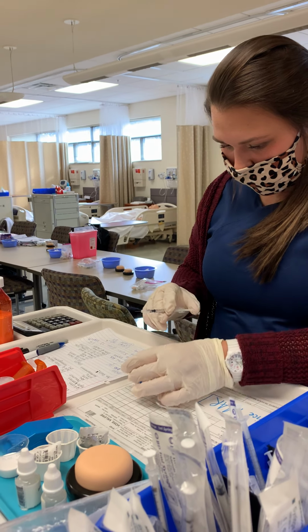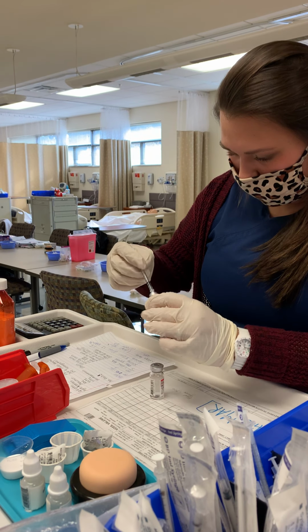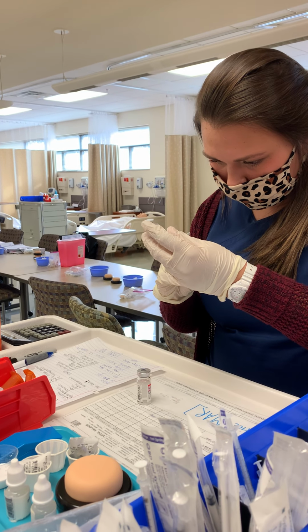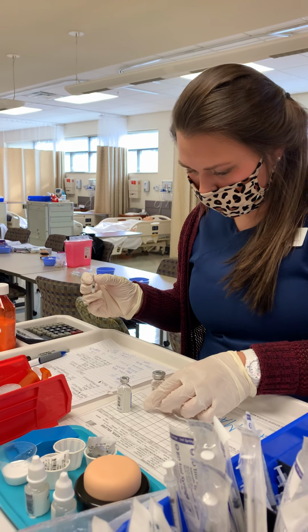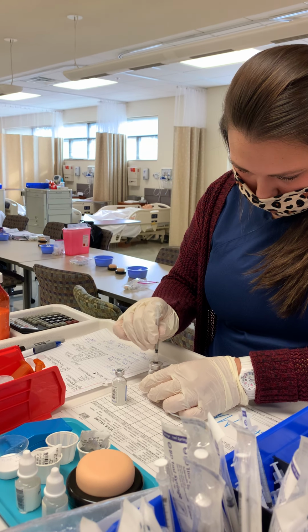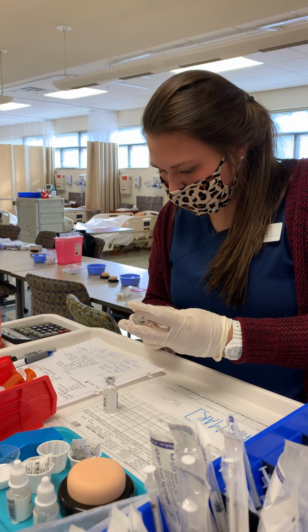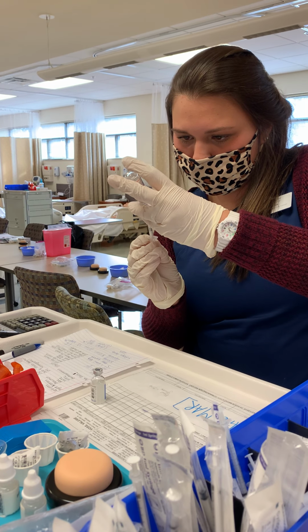I'm going to inject my air into the cloudy. For the cloudy, I'm going to inject 6 units. For my regular, I'm going to inject 5 units. And then I'm going to draw 5 units of my regular.